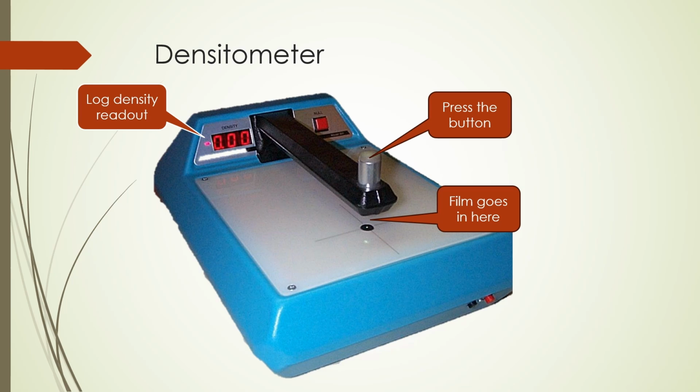Repeat this operation 11 more times and you will have the data necessary to produce a densitometric curve of the penetrometer image. Densitometric curves were extremely useful when one wanted to evaluate the effects of technical changes such as MAS, KVP, collimation, etc. on a radiographic image. Generally, curves demonstrated the effects of technical changes on photographic properties.